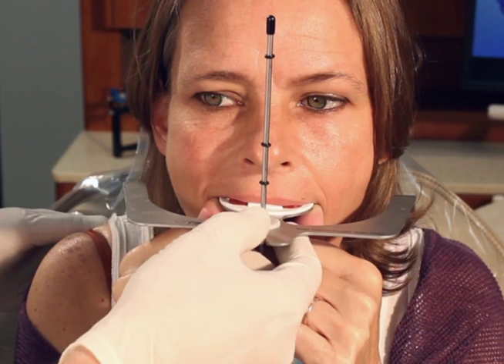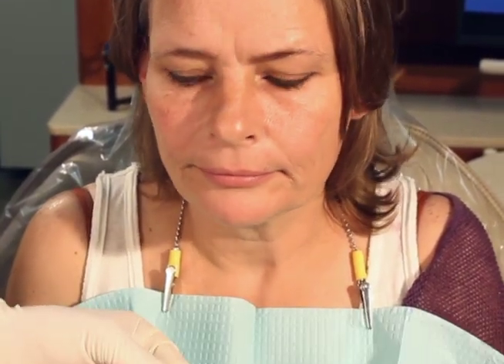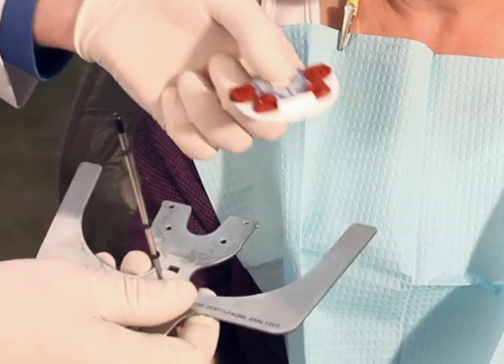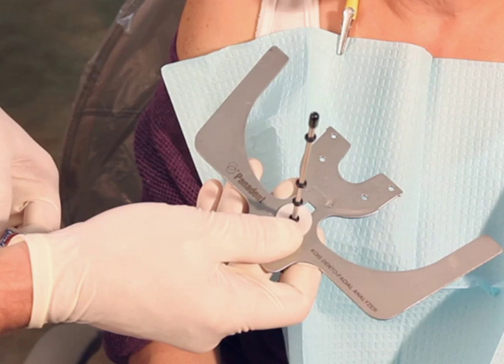Now that we've verified this position, we can remove this from the patient. We can actually remove this index tray, which creates a permanent face bow registration record — kind of a first in the industry. We can put the patient's name and date on this and use it at a future time for mounting the maxillary casts. The bow can be cleaned and kept in the operatory for use with the next patient.